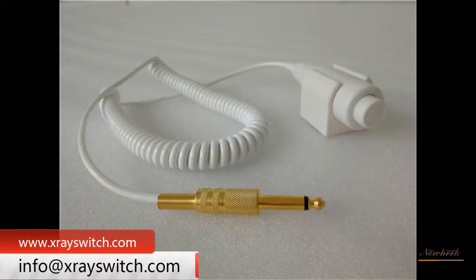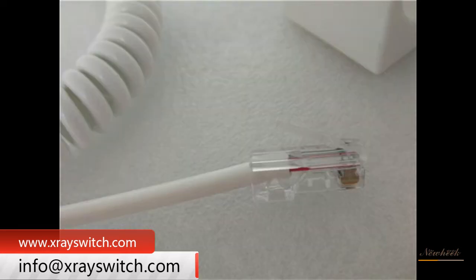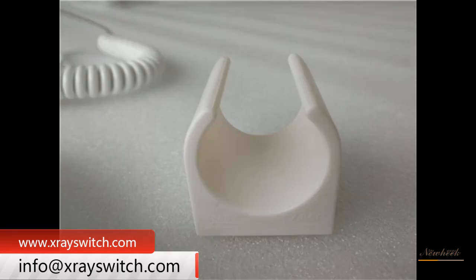Equipment to control X-ray exposure can also be used to control the electrical signal on and off, for photographic equipment and medical diagnostic X-ray machine photographic exposure. In general, an ordinary X-ray machine is equipped with a 2-speed X-ray hand switch. The X-ray hand switch provides flexible control and is easy to apply.